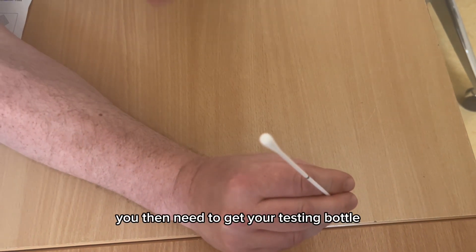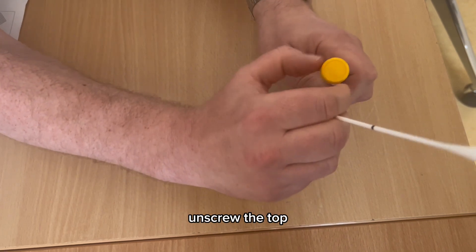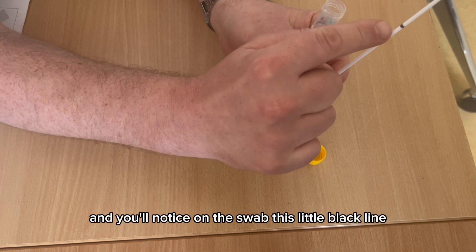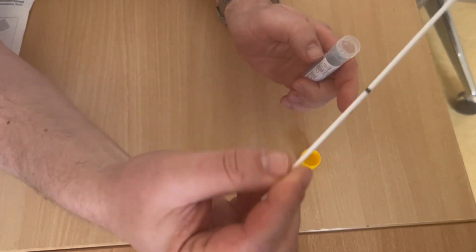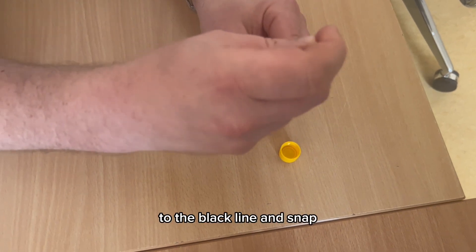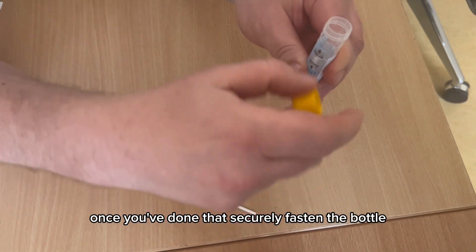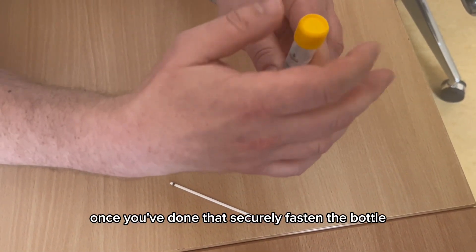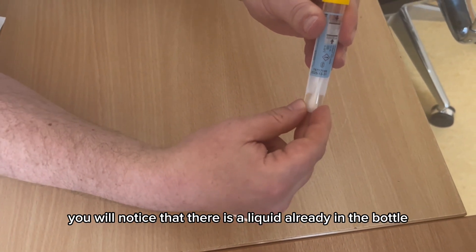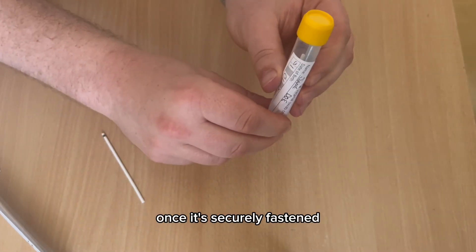Get your testing bottle and unscrew the top. You'll notice a little black line on the swab — put the swab into the bottle to the black line and snap. Once done, securely fasten the bottle. You'll notice there is liquid already in the bottle; that's meant to be there — do not remove it.